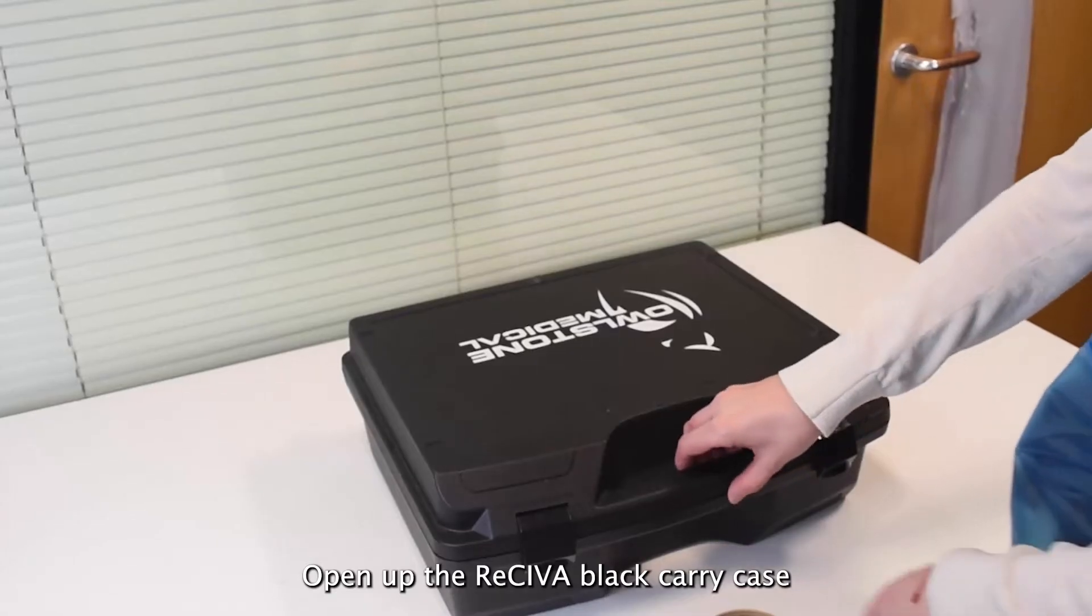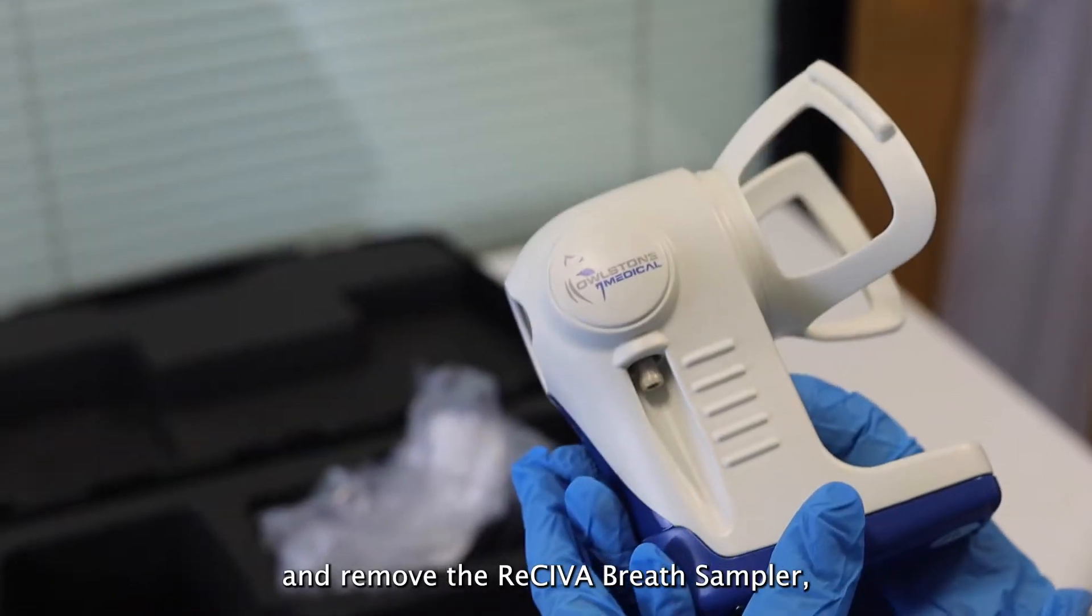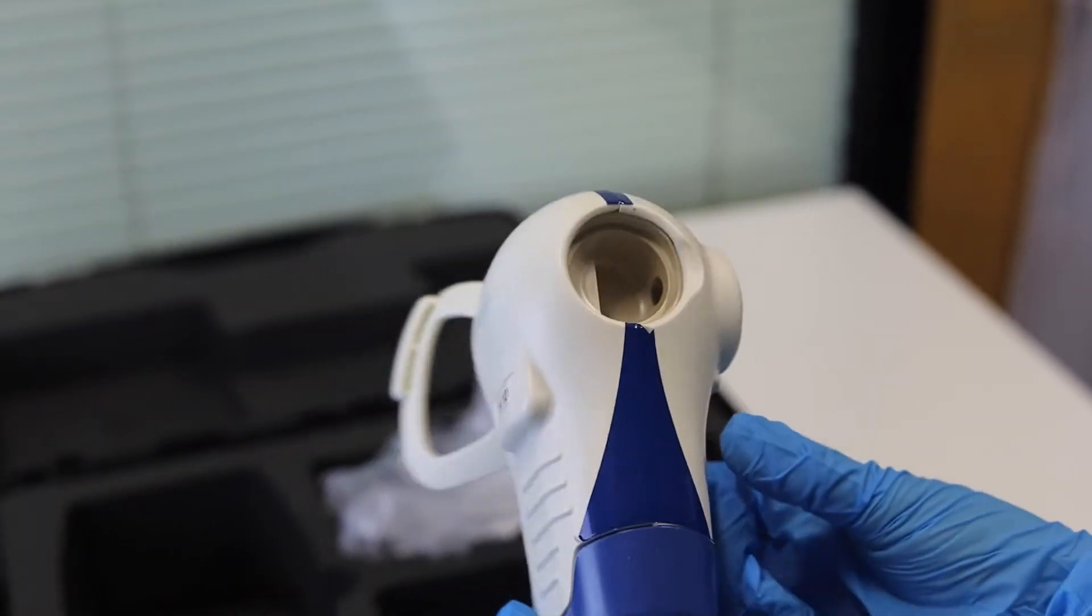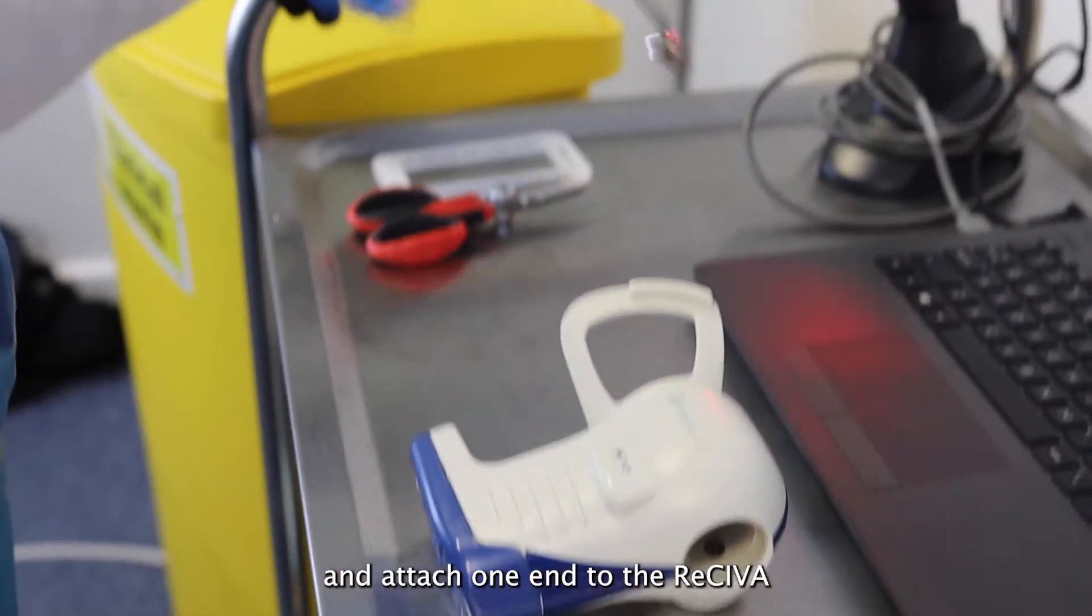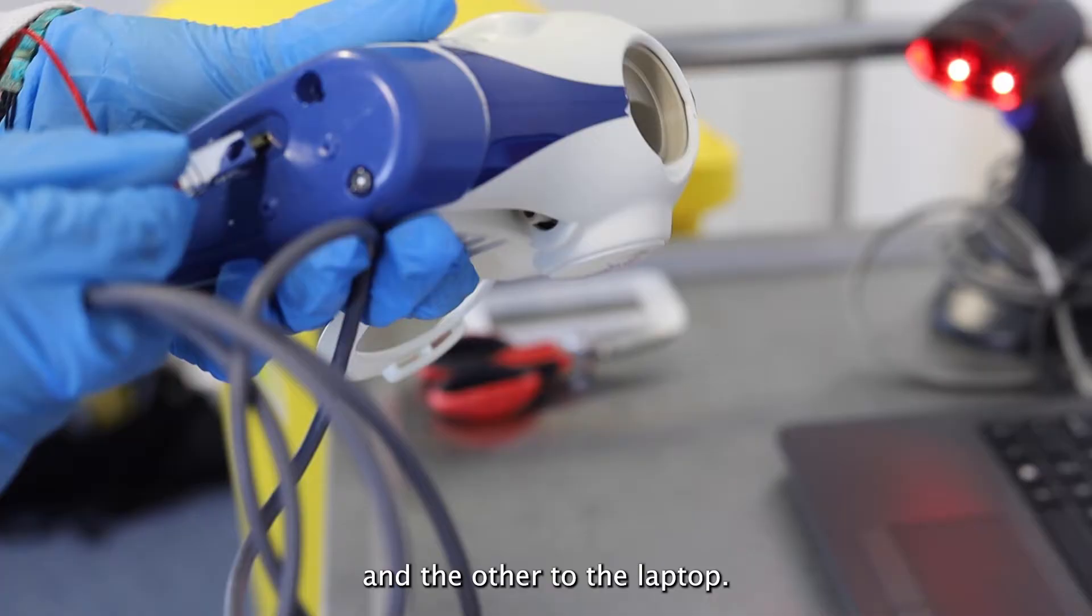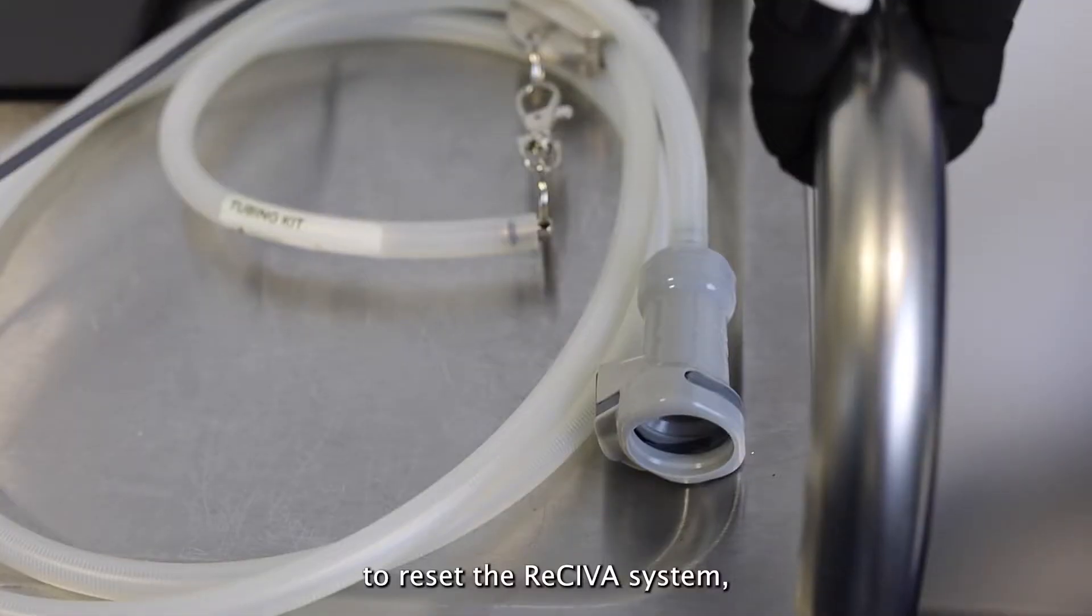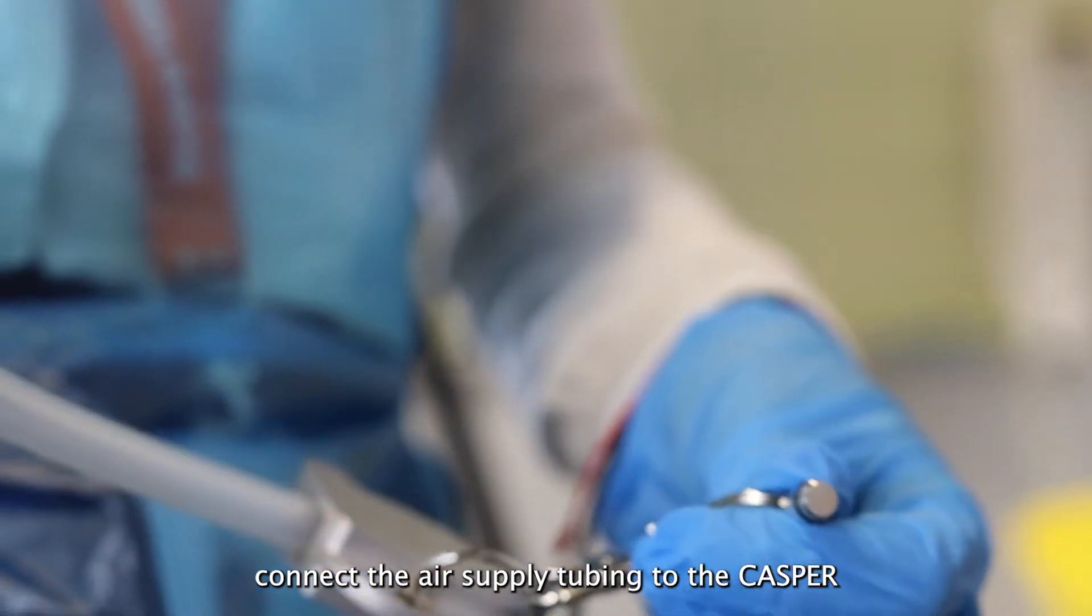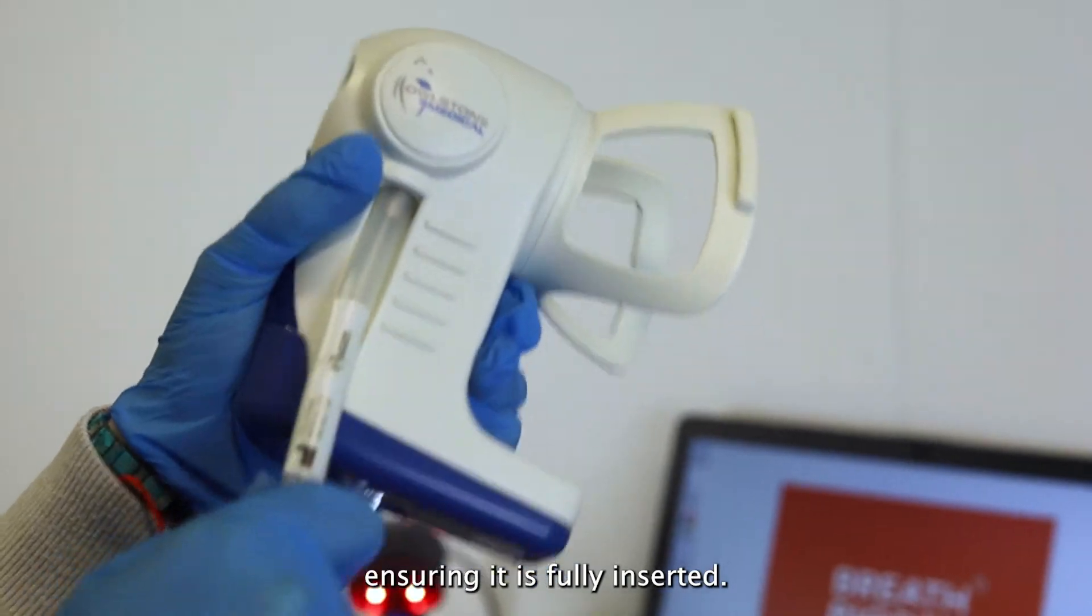Open up the ReCIVA black carry case and remove the ReCIVA breath sampler. Unwind one of the ReCIVA USB cables and attach one end to the ReCIVA and the other to the laptop. This powers the ReCIVA and should be disconnected at the end of every use to reset the ReCIVA system. Connect the air supply tubing to the Casper and remove the bung, then connect the tubing to the ReCIVA ensuring it is fully inserted.